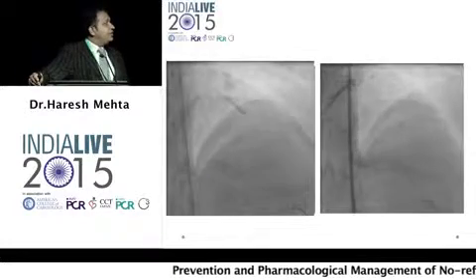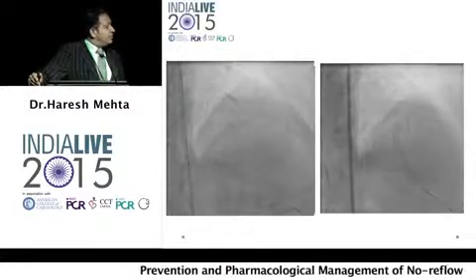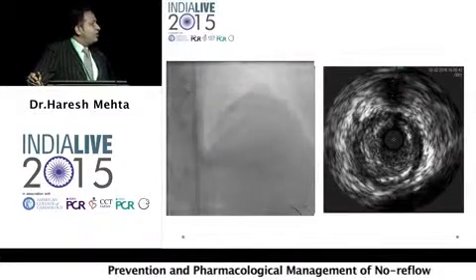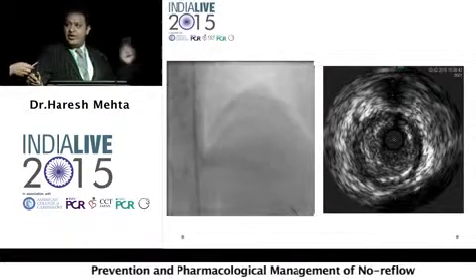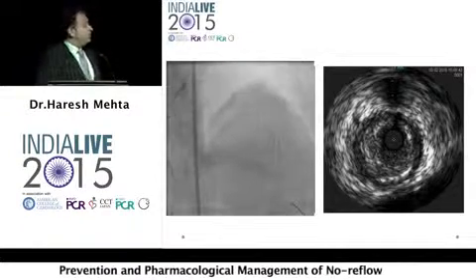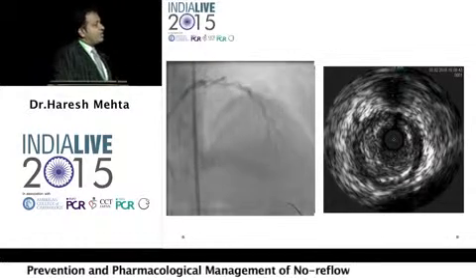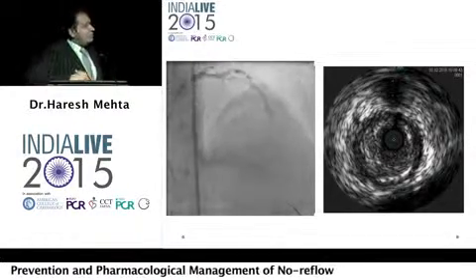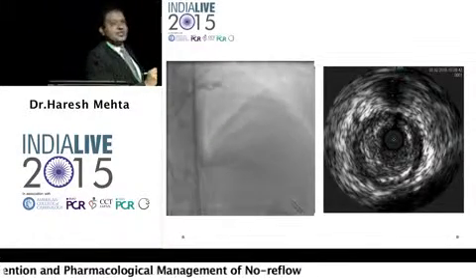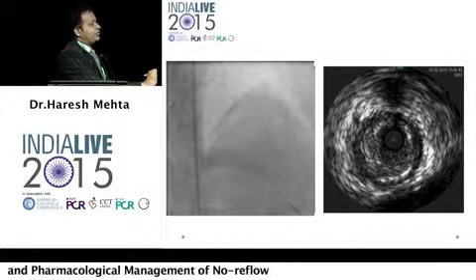There's the pre-dilatation. There is some flow, but still not great. Next, please. Can we run the first the angio and then the IVUS? The first the angio only. So you see almost slow flow, no flow at all. Can you run the IVUS now? So what IVUS tells you is that the distal vessel is normal. There's nothing there. You see that? It's clear, absolutely clear.